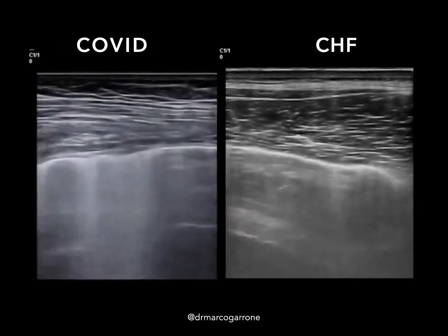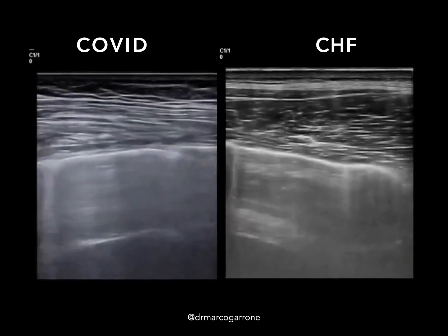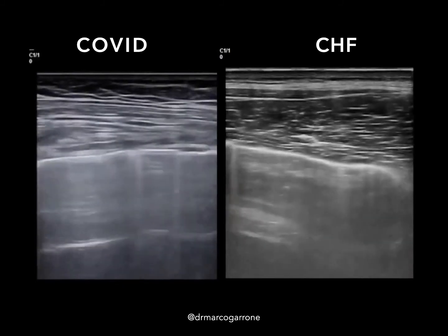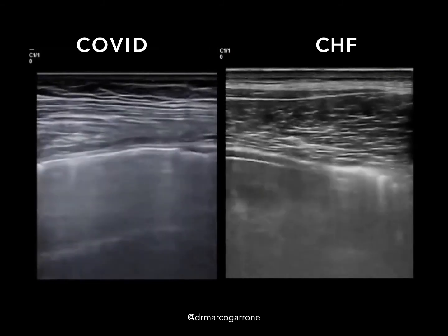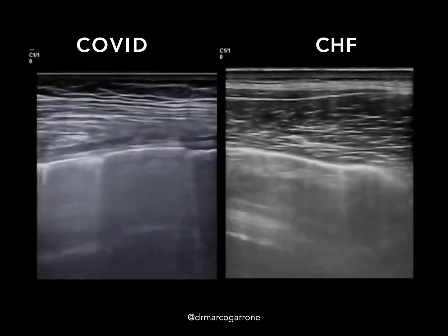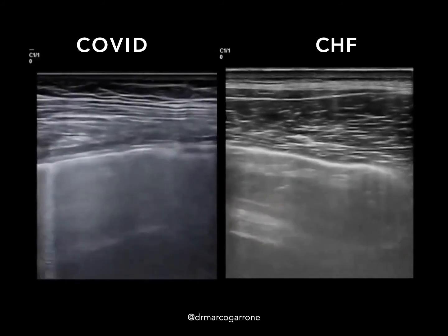One clue to help distinguish between COVID versus pulmonary edema is to look carefully at the pleural line. This is an example from an Italian physician, Marco Garrone. The clip on the left demonstrates a pleural line that's irregular, and that's in a patient with COVID, while the clip on the right has a nice smooth pleural line, which is in a patient with CHF.